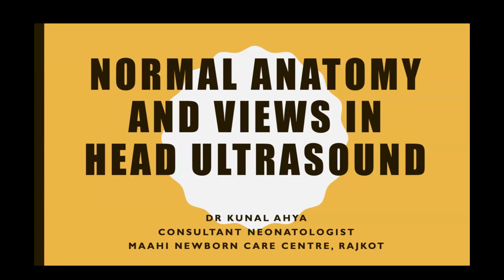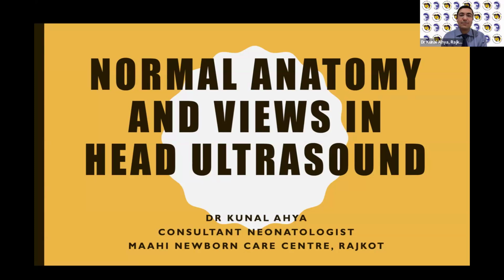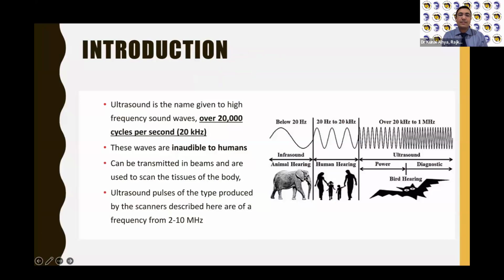So today I will be talking about the normal anatomy and the views in the head ultrasound. So basically, what is an ultrasound? It is the name given to the frequency which are beyond the human hearing. So we usually do not hear any sound while we are doing an ultrasound, but it is the beam which passes through the body tissues and we can get the images from it. So usually it is measured in the frequency of 2 to 10 megahertz.